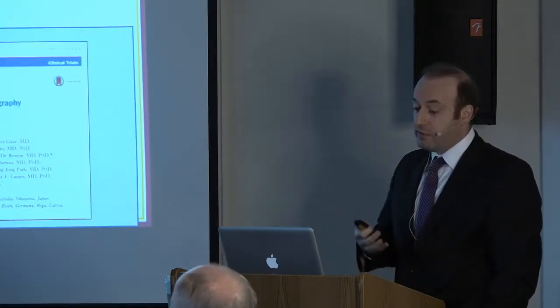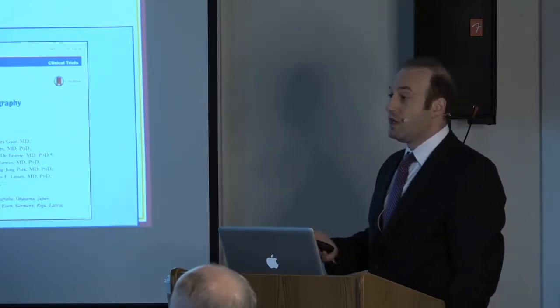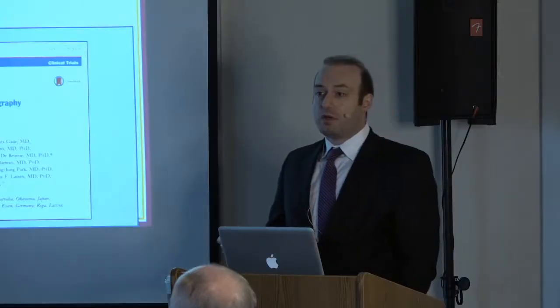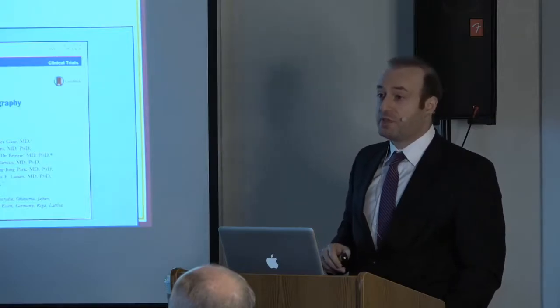Thus far, there have been 3 prospective multi-center trials looking at the diagnostic performance of non-invasive FFR CT compared to invasive FFR as a reference standard, published in high-impact journals such as JACC, JAMA, and the most recent NXT trial published in the Journal of American College of Cardiology as well. The NXT trial was completed in 2013, 10 worldwide sites, and they reported a per patient sensitivity and specificity of 84 and 86% respectively.